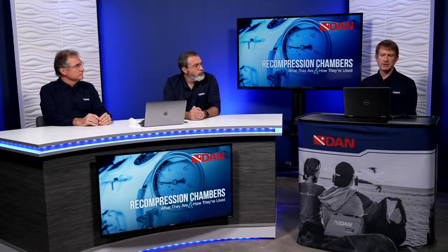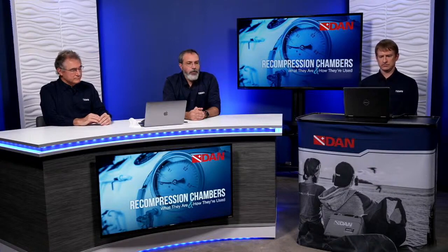I seem to remember Table 6A being used for treatment of certain instances such as AGE. Is this still the standard, or is Table 6 now more common? So keep in mind that these treatment tables were meant and designed by the US Navy. So it's a different kettle of fish. The Navy diver is different than a Joe diver out there.